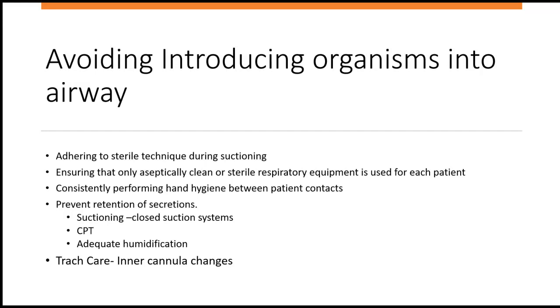So in order to guard against infections, we as respiratory therapists should avoid introducing organisms into the airway. Okay, so our main goal is not being the reason why organisms got down in the airway. And we can do this by adhering to sterile technique during suctioning, ensuring that only aseptically clean, sterile respiratory equipment is used on patients, and consistently performing hand hygiene between patient contacts. Hand hygiene is going to be a really big deal to all of you once you get out into the hospital. So make sure you wash your hands and make sure you wear gloves.